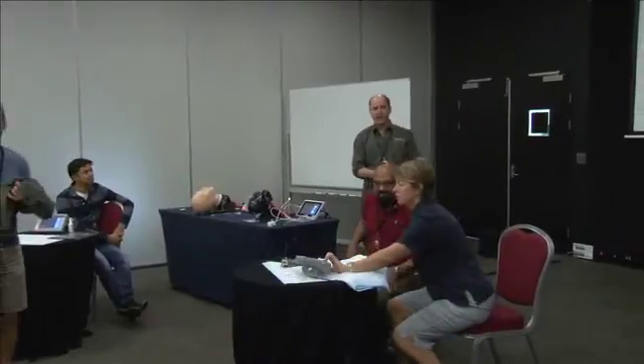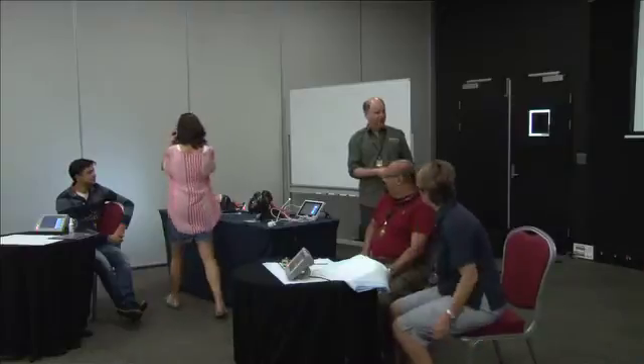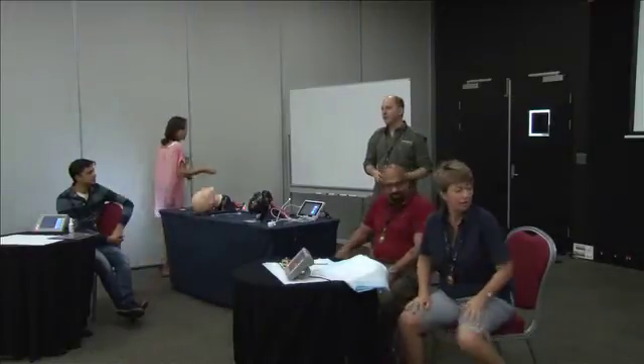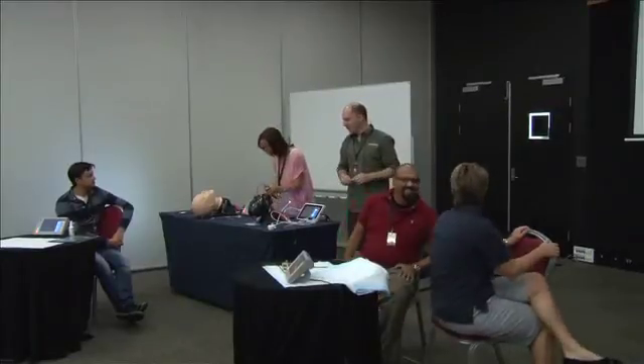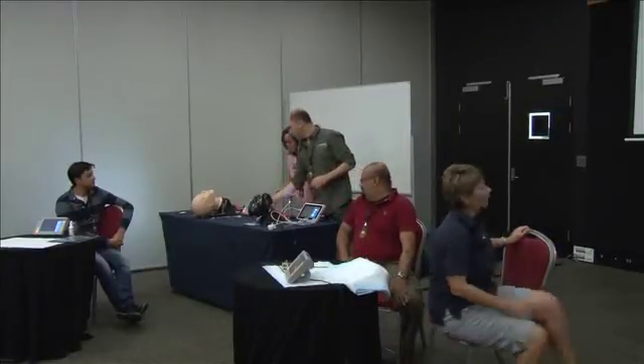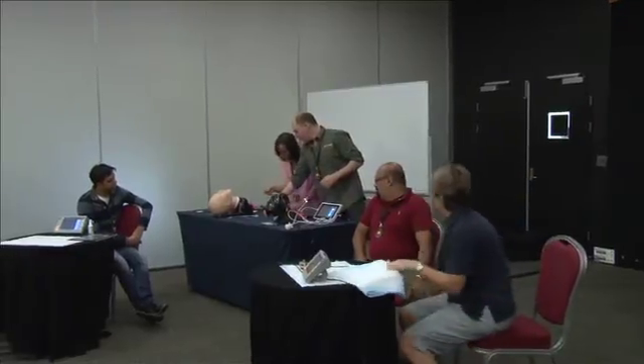I used to think fiber optics were really difficult, but what I've discovered is it's a skill set like anything else. There are some rules to performing it, and we're going to go over those so we don't break the scopes.